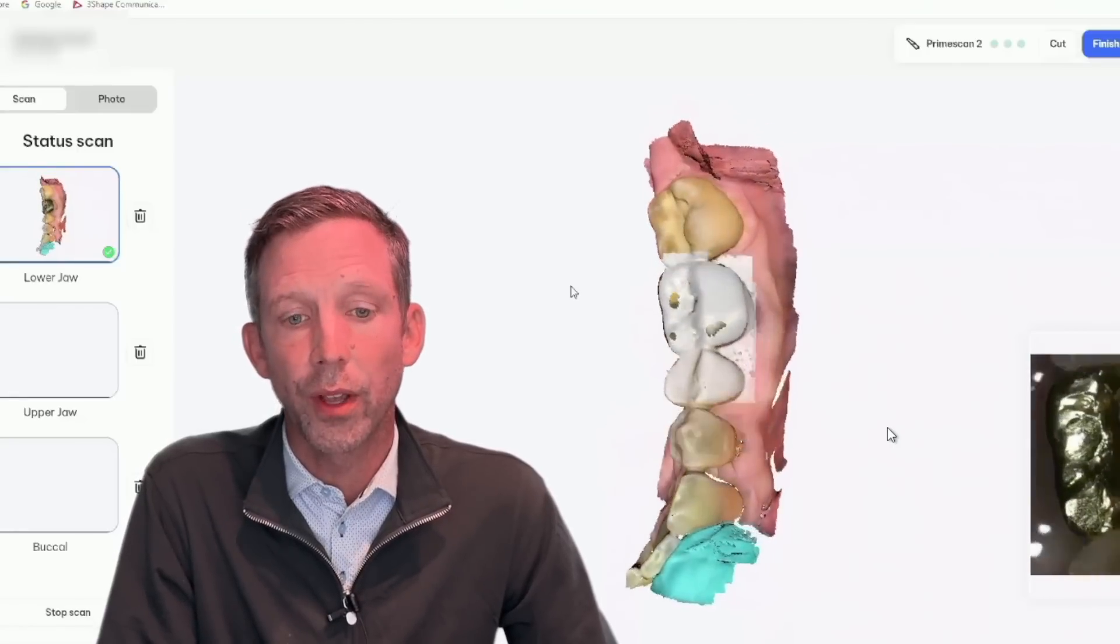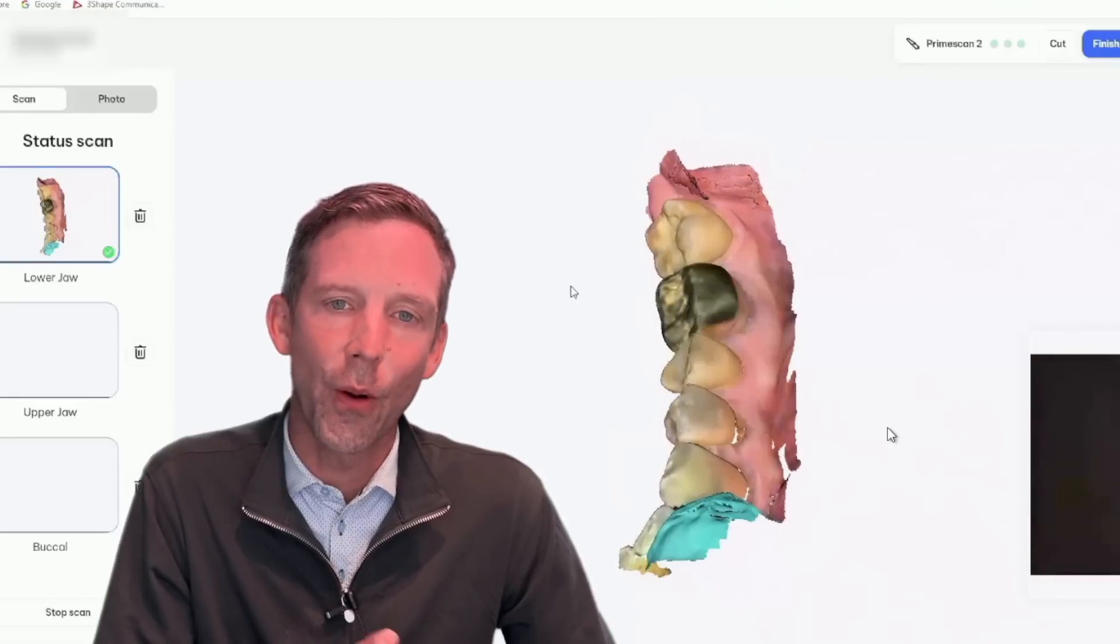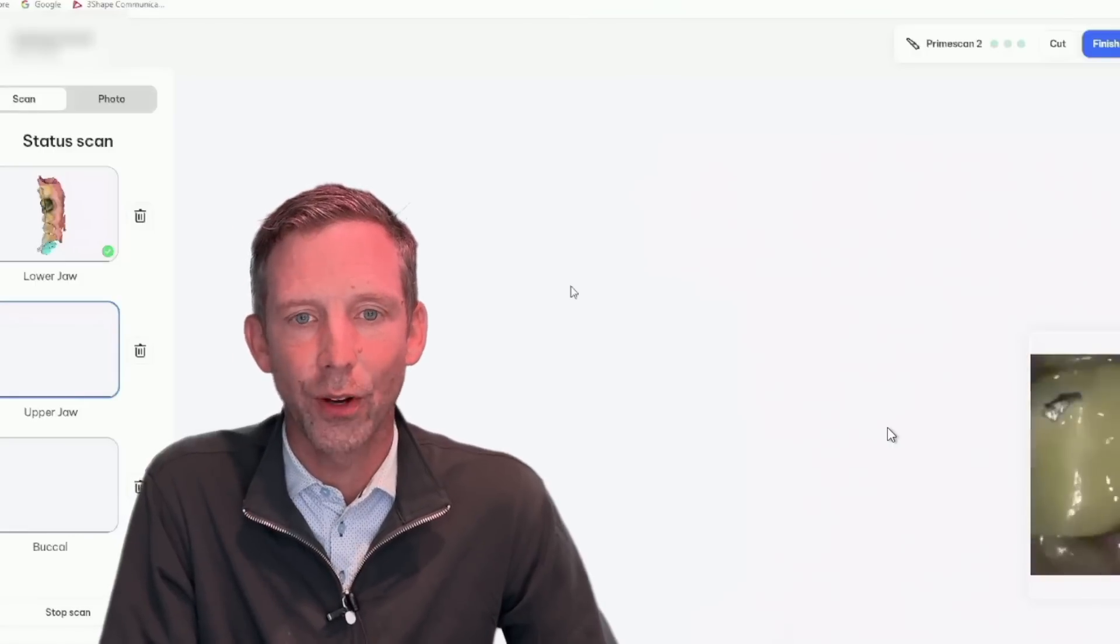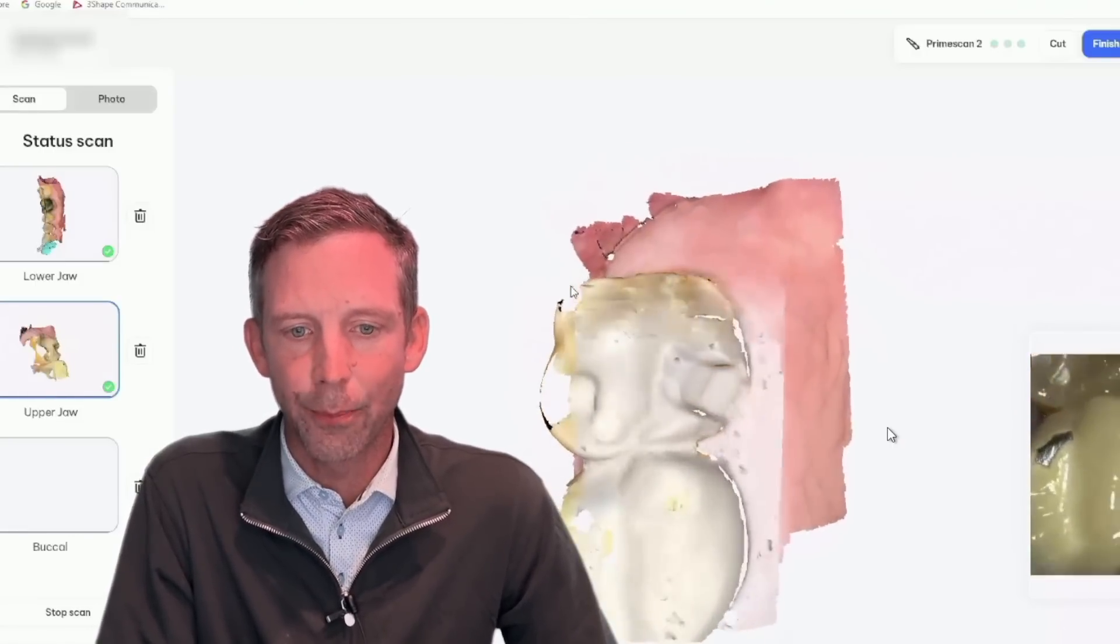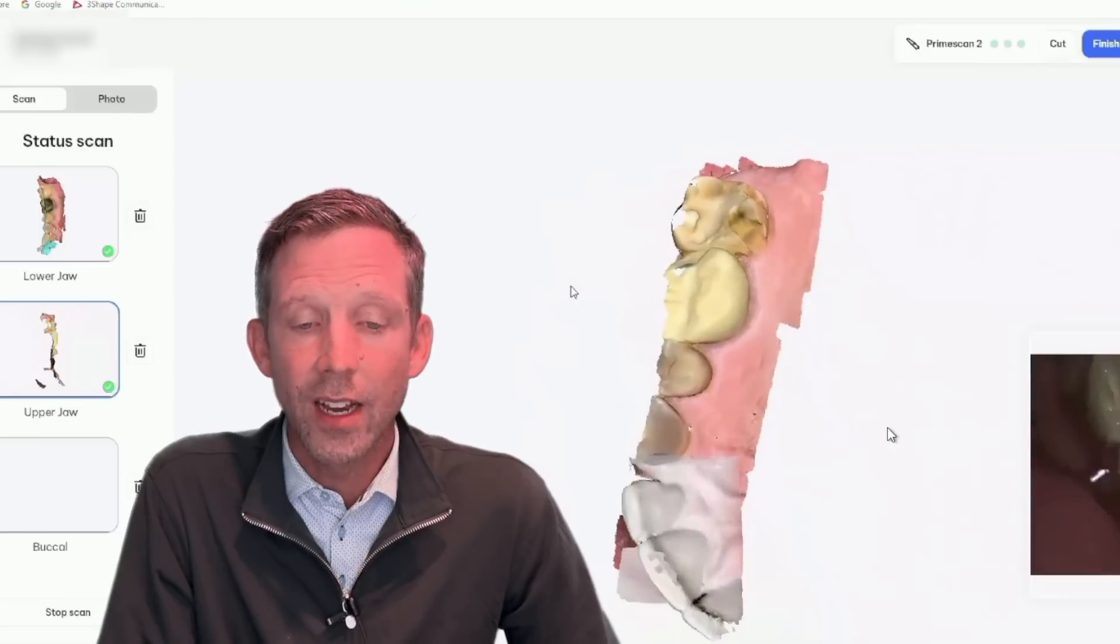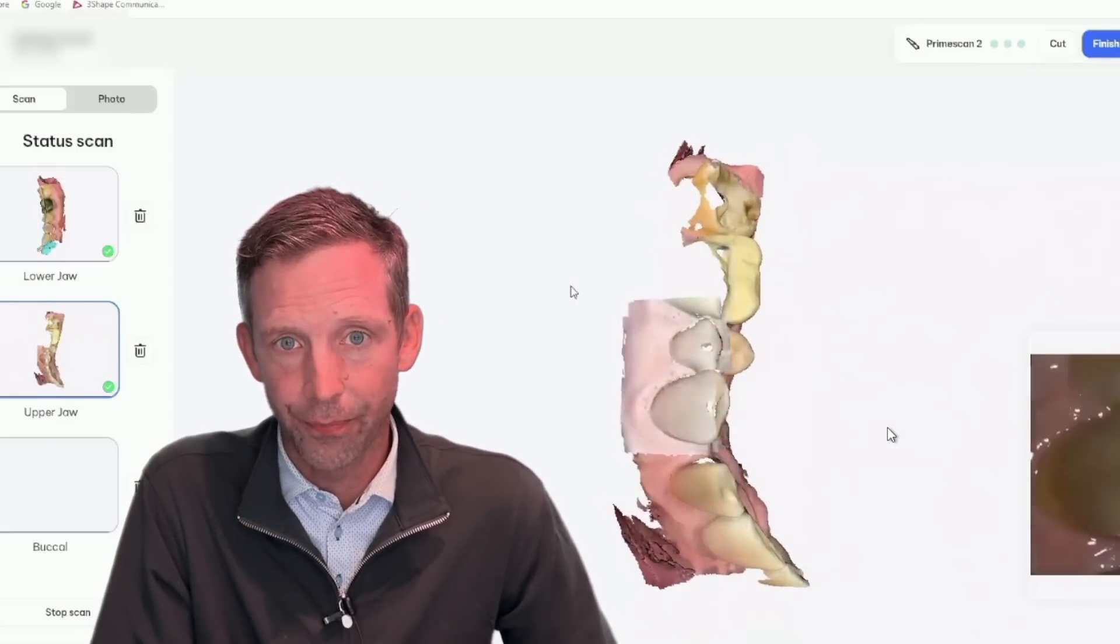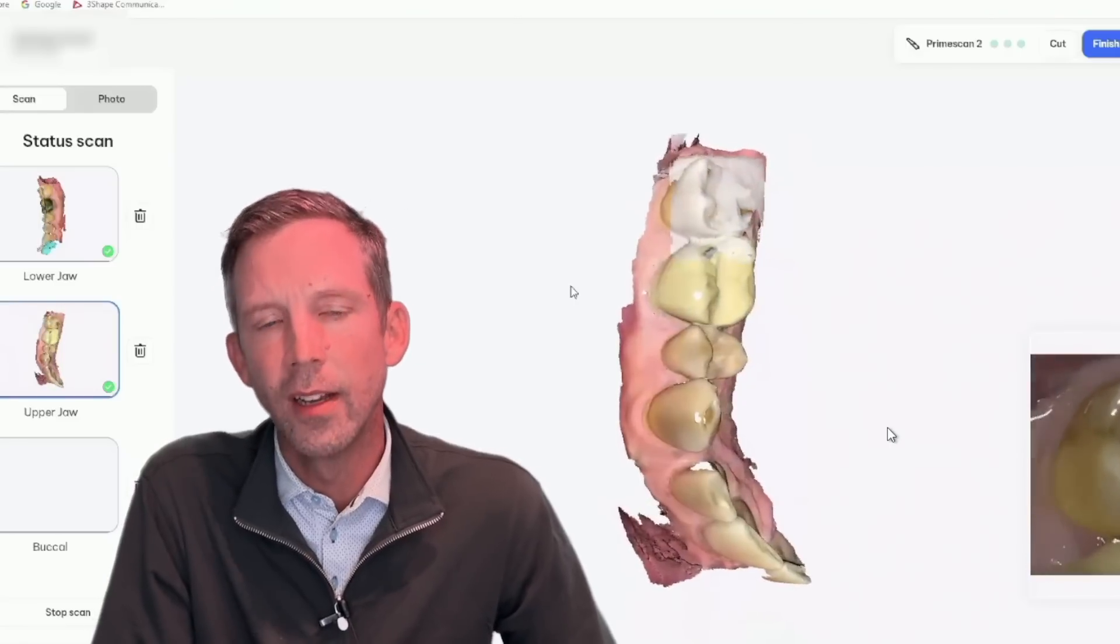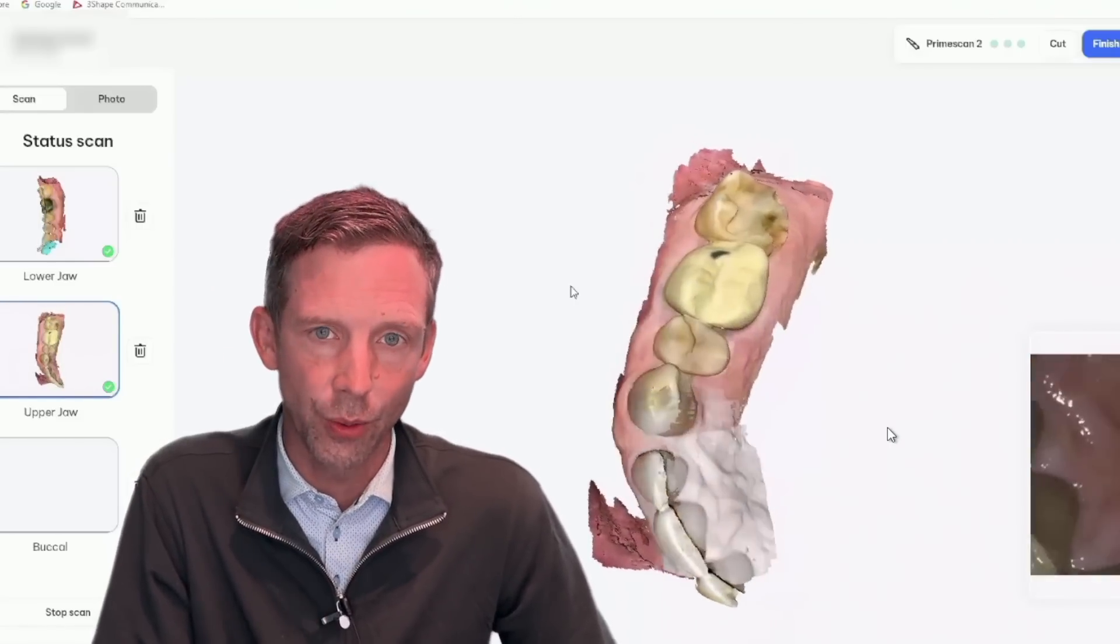So we go ahead and scan the lower arch. And then once we're done doing that, we'll go ahead and double click that little dot. We'll switch to the upper arch and we're going to scan the pre-op of this particular tooth. So this is the broken tooth number 15 that I talked about a little bit. Now I'm doing this while the patient is actually numbing up.